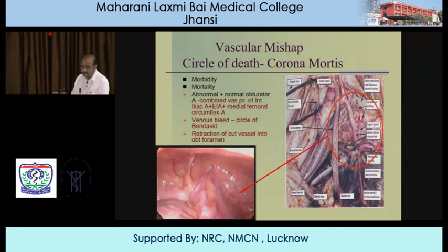Now, when you're doing an open surgery, what do you do? You use retractors. When you use the retractors, you can see what's lying inside. Agreed? You have to have proper vision. But you're not applying any retractors inside when you do laparoscopy. What is there? Just three small holes. So how do you create that space? By gas. But known as a pneumo retraction.